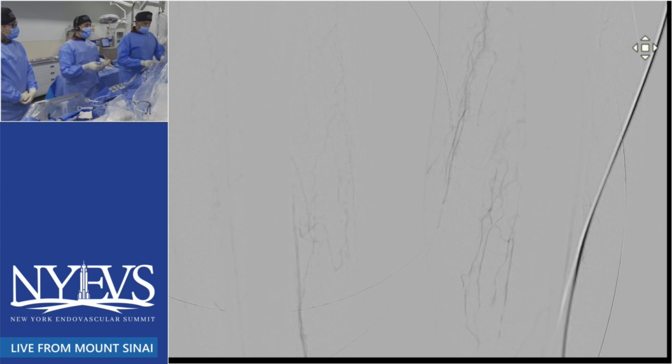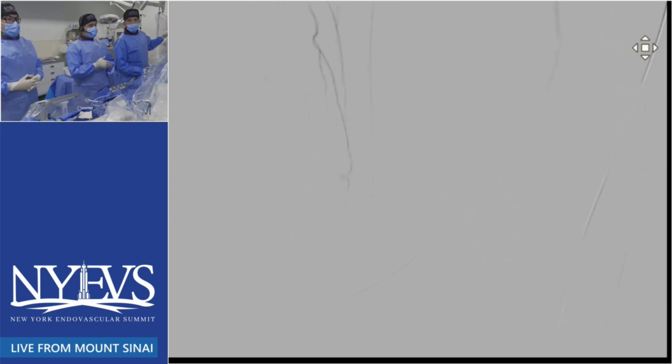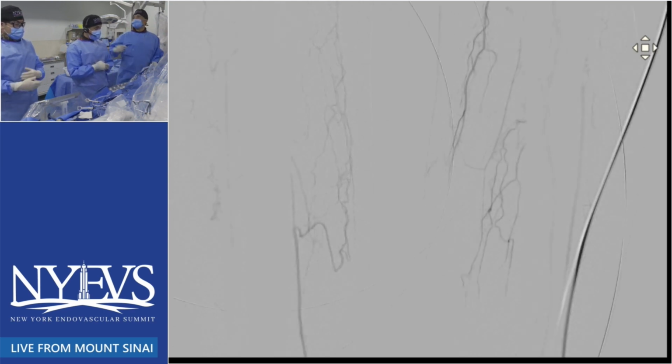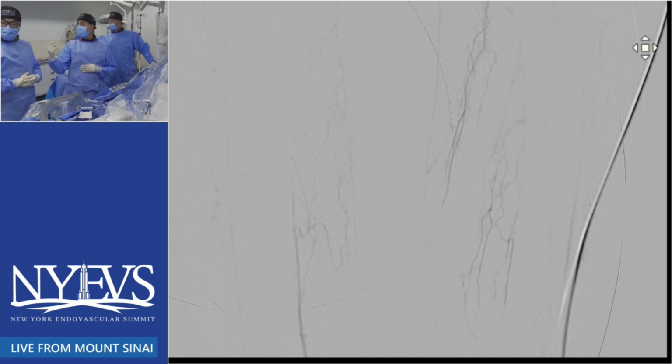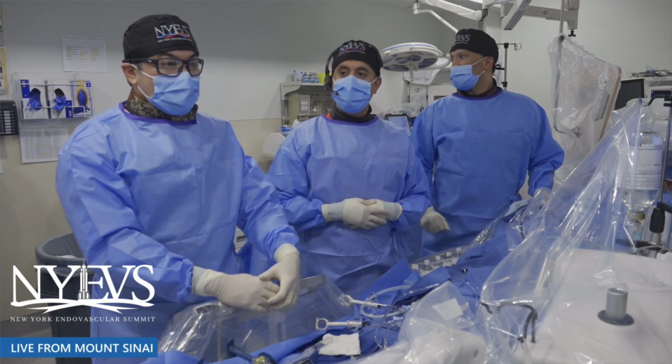Sorry, I have a mic going. Okay, I'm going to ask the panelists how they would approach this case. Go ahead. Yep, I was about to ask the panelists to see how they would approach this case. You would turn on the mic, guys.